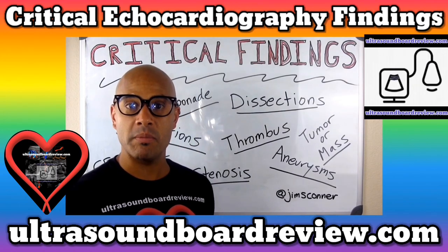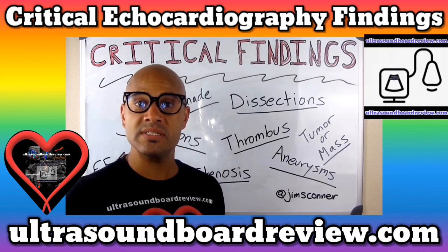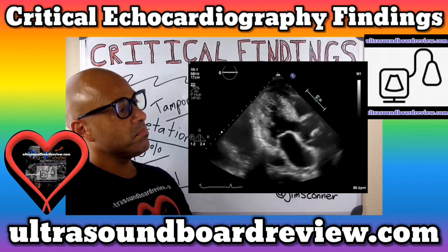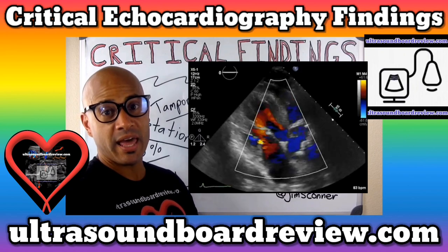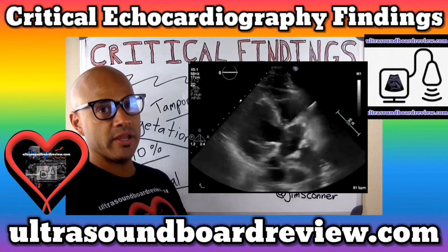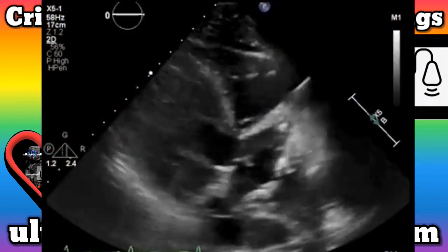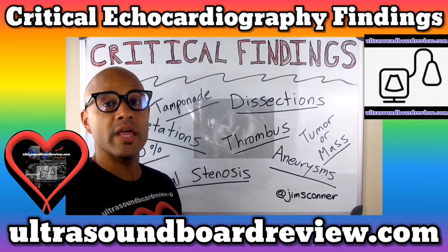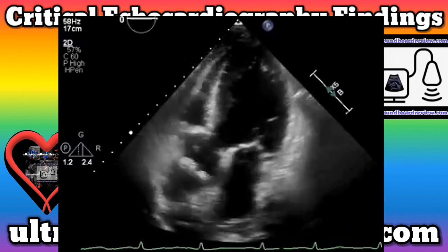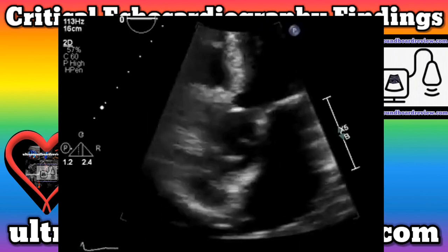In this next echo, this was ordered as a routine for a post-myocardial infarction patient who received three stents and was sent back to the room. Here in the parasternal long axis view, the EF is down, as expected coming from the cath lab with three stents. I'm going to pause and run a cine loop on this. I'm going to go to the apical five chamber view — do you see anything in the ascending aorta? Looks like there's plaque buildup, and with each systolic contraction, they tend to move. Is this something critical?